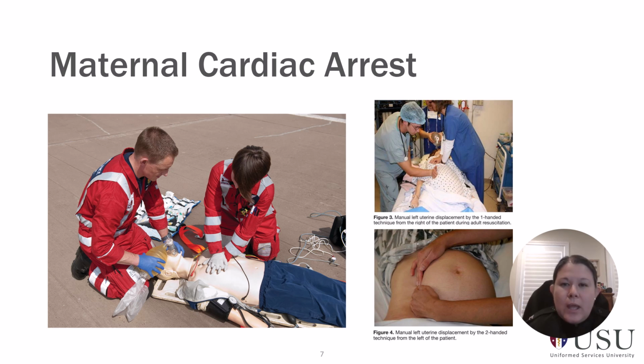And so I think the important thing here is to really look at newer simulators. Laerdal is developing one that's not yet on the market, but was used in the clinical trial, showing the benefits of maternal cardiac arrest simulation. And this new simulator obviously has a gravid abdomen. It's sort of like the resuscitative Annie mannequin, but has the gravid abdomen with a uterus that can be displaced.